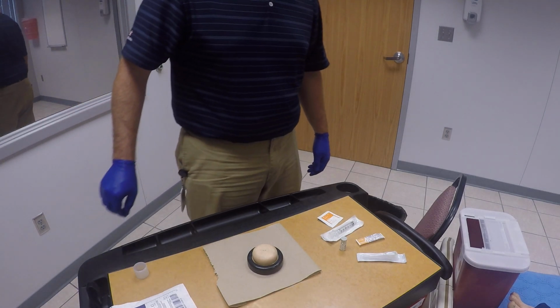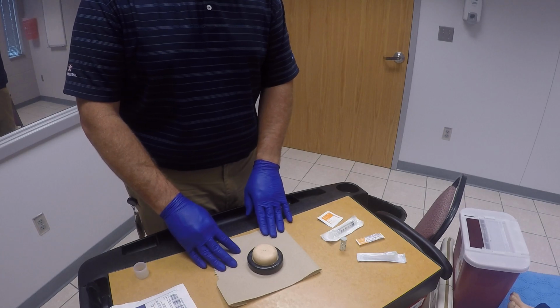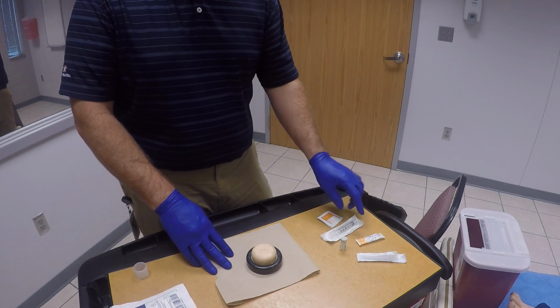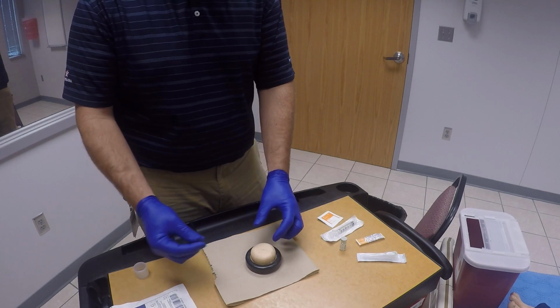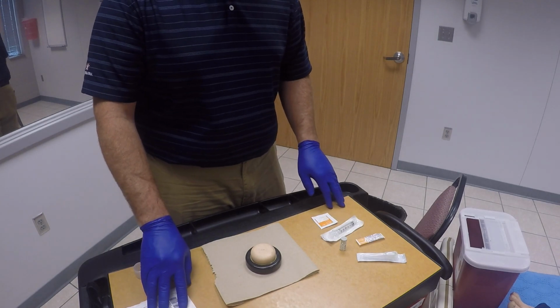Alright, this is intramuscular and subcutaneous medication administration. Today I'm going to show you the intramuscular way. Subcutaneous is pretty similar. You can use a little shorter needle and then you'll go in at a lower angle. We'll get started here. First thing we want to do is make sure we have all of our equipment.